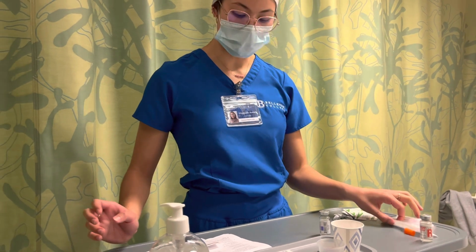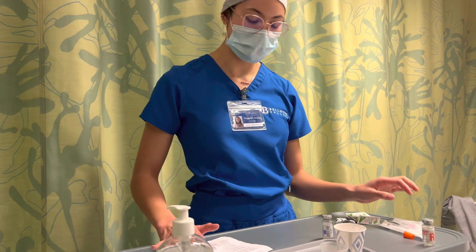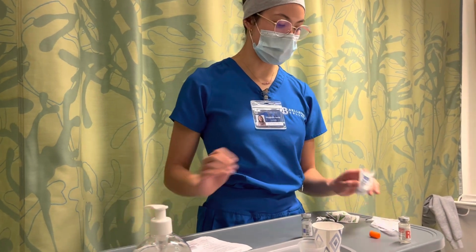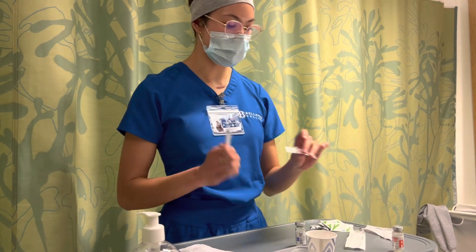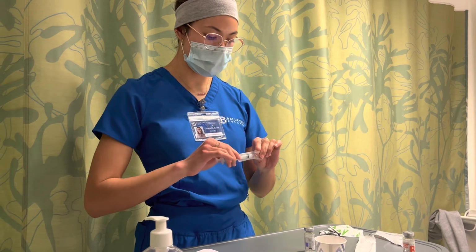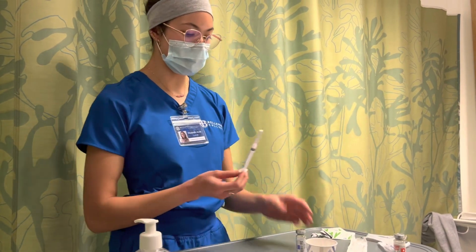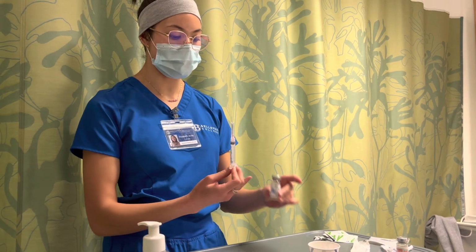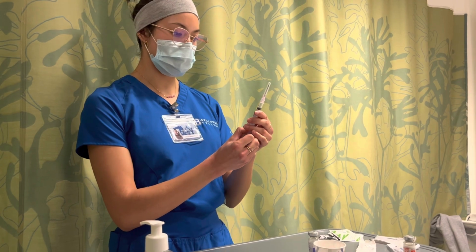So we're going to draw up, we have Ketorolac 15 milligrams ordered. So we're going to draw that up. I already cleaned the vial. I'm going to attach my blunt needle here. And this is 15 milligrams per mil. So we're going to be administering 1 milliliter.